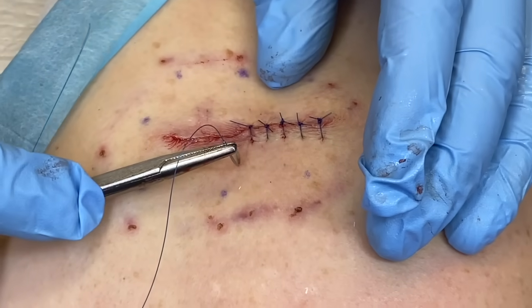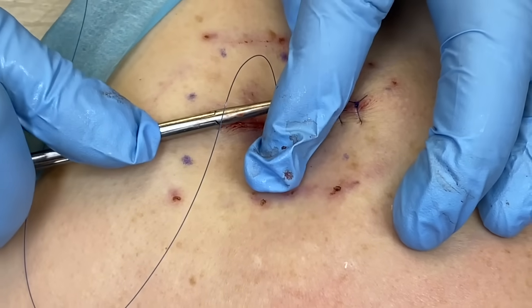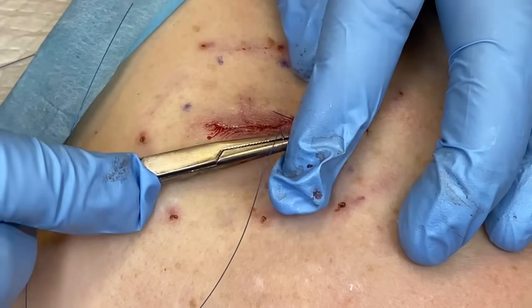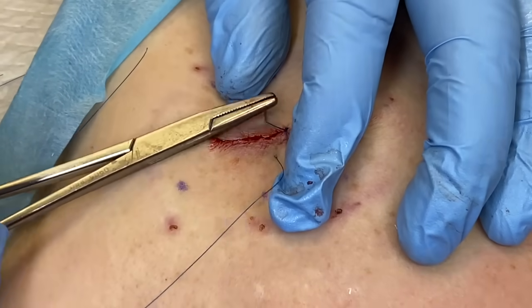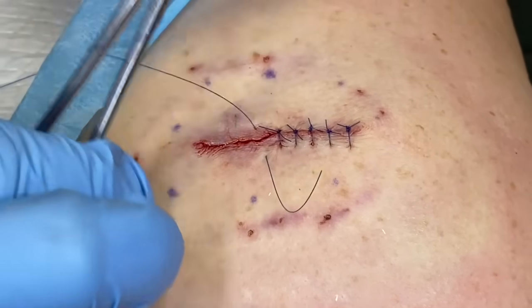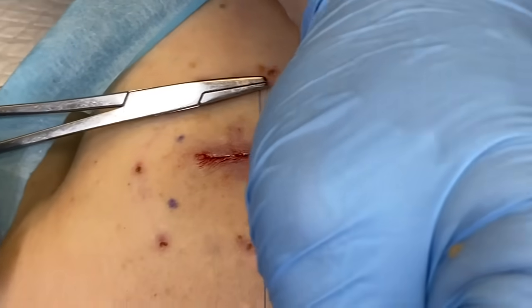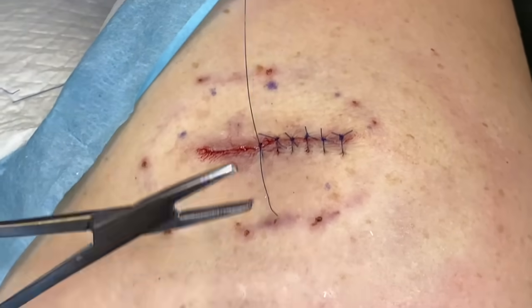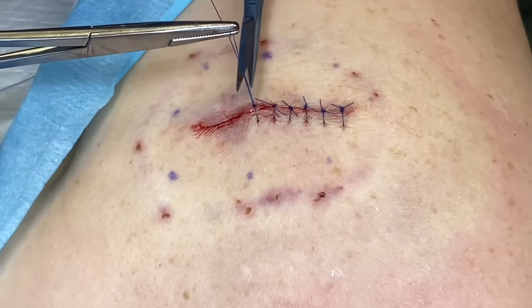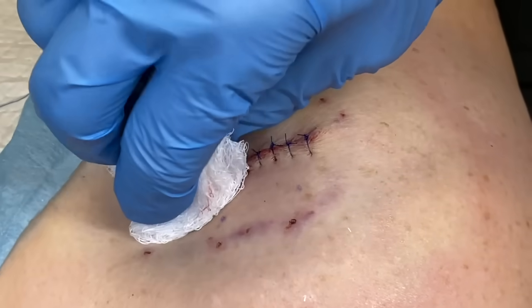So here when I'm putting it in, it'll look like I'm going in at this angle, but you always are flipping it quickly and going in at 90 degrees, and then once you're in, you shift it. You just do it quickly enough that it looks like you're going at an angle. It won't be a problem for her because she has nice normal skin, but any significant laborer, male or female, and you'll see it worsening in big males, they can have really thick skin, and you'll bend your needle, even if you do it the proper way. But if you don't put it at 90 degrees, you won't really get it through their skin at all.